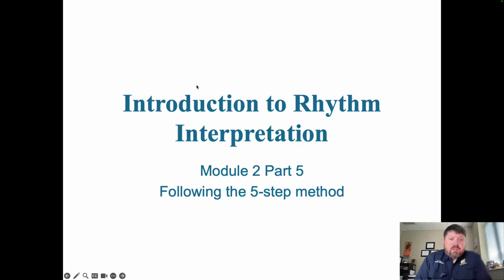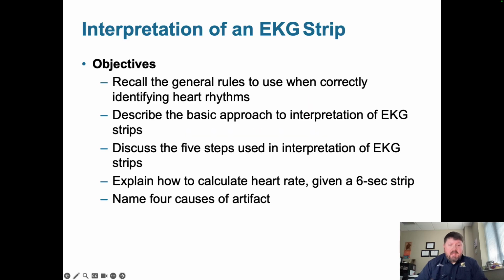Part 5 of Module 2, this is where we're going to lay the foundation to really begin to interpret rhythm strips. And this is a very, very important part of this class. We want to make sure that we hit these objectives and that by the end of the lecture, by the end of the class, you have mastered these objectives.